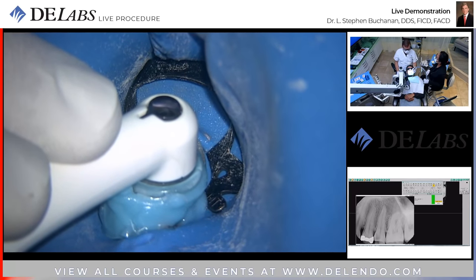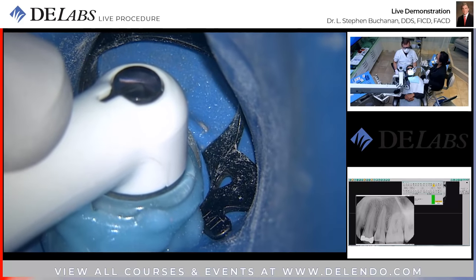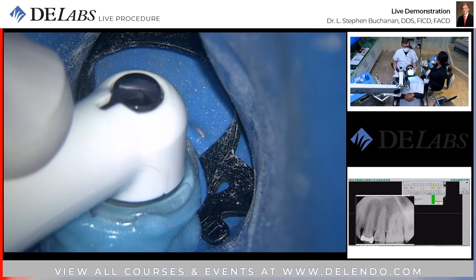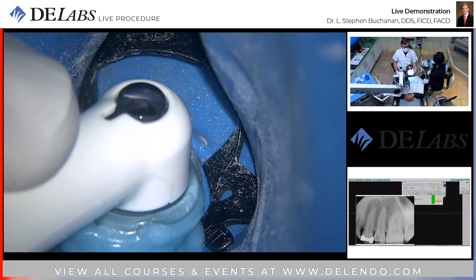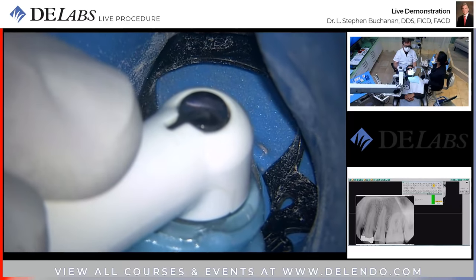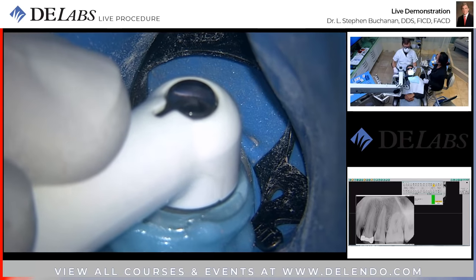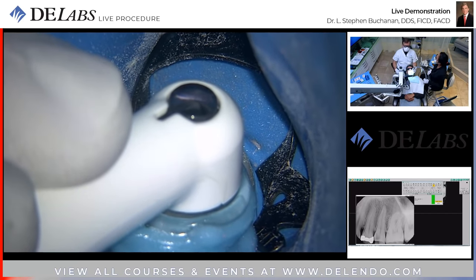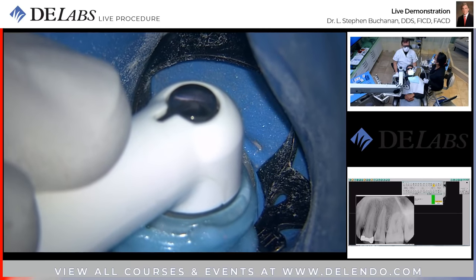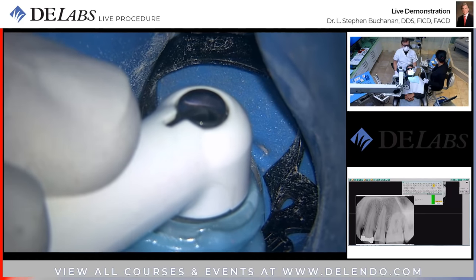Next time we do a demo, I'll have a copy of Erica Branson's beautiful video showing the vibration of the solutions and the junk in lateral canals all the way at the end of the root canal. It's amazing. There's almost more activity in the smaller parts of the canals at the end of the root than there is in the more coronal, more accessible areas. And I think that's probably because of the concentration of sound energy, just like a hearing impaired person used to have an ear trumpet, and that would take sounds and concentrate them down to smaller and smaller diameters of that inverse trumpet. And so it did intensify, and I can't imagine the root canal isn't a perfect shape for that to happen as well.